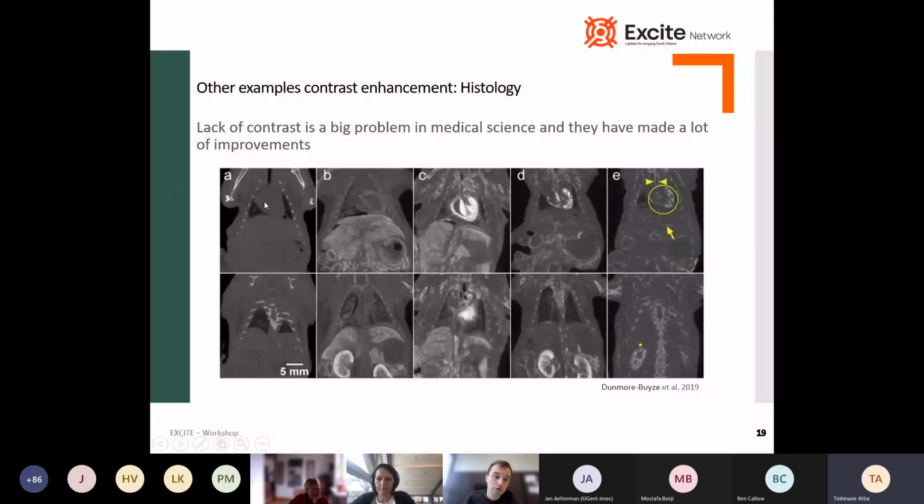Like here, in A there's no contrast, you only see some tissue and some bone. But when you add different contrast agents, such as B, C, D, and E, you can see different features depending on which contrast agent you are using. For example, C will enhance the attenuation of the heart very much, while B might be very interesting for the kidneys, or D also for the kidneys. So here it also shows that you can use a lot of contrast agents, and they all have different pros and cons. It's not always that easy. It all depends on what you're interested in.